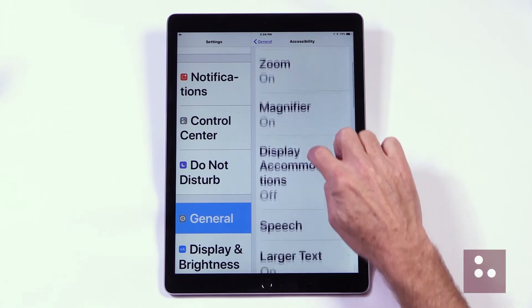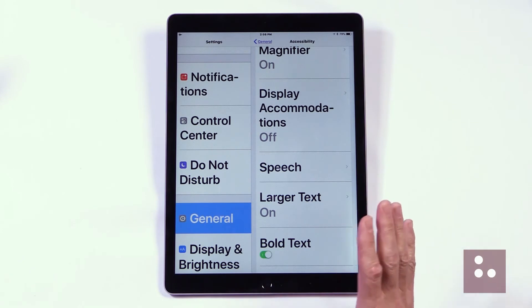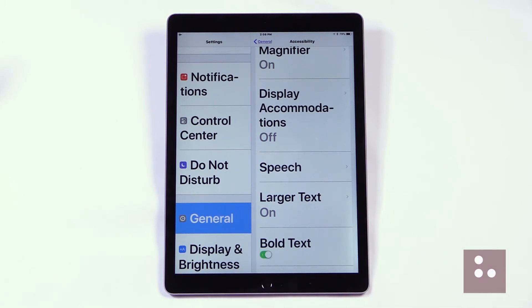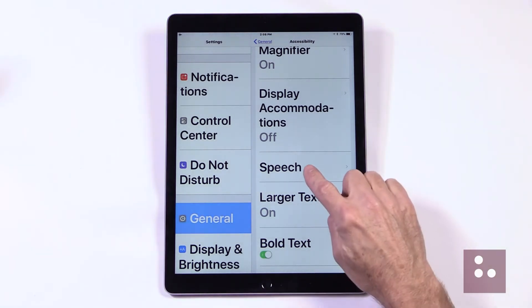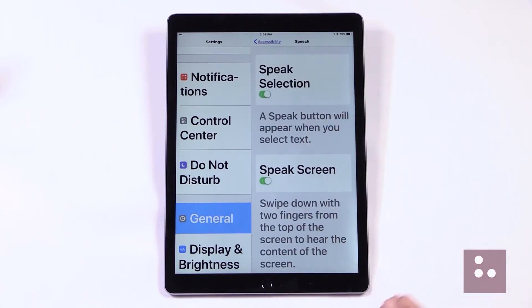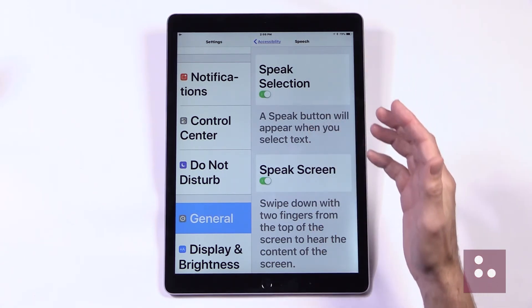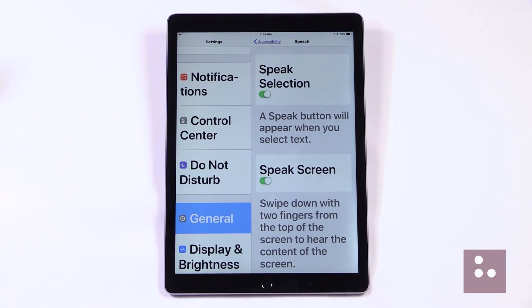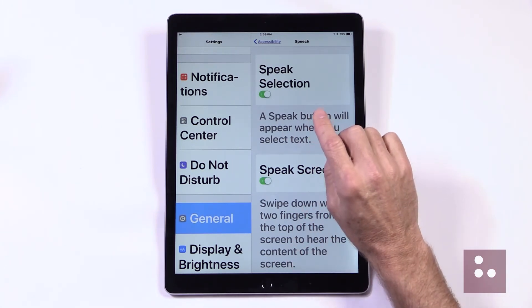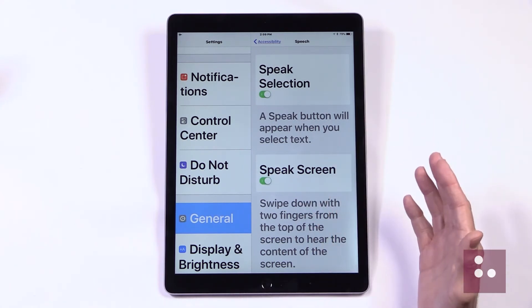Just below our Display Accommodations button, we'll find our Speech button. We have some really great speech features here, so let's go ahead and tap our Speech button and quickly check it all out. Our Speak Selection feature is the first item in our list here, and our Speak Selection feature is another one of those items that can really help to reduce eye fatigue. This feature is super useful for reading smaller pieces of text that we have selected.